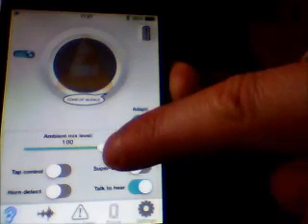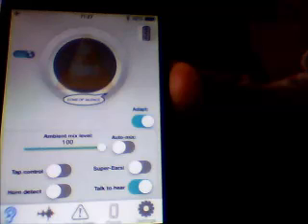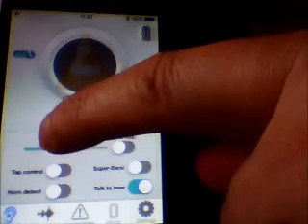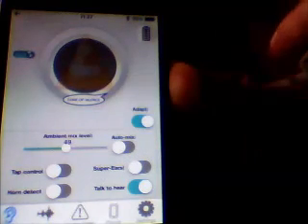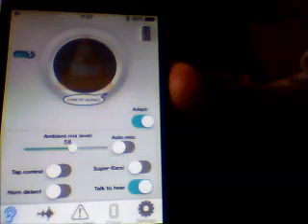Now this auto switch here sends a BTLE command to automatically adjust the level of ambient sound passed through to the earphone. When the auto mix switch is off, we can manually adjust the level of ambient sound passed through to the earphone with this slider. This slider sends a BTLE command to adjust the ambient sound gain.